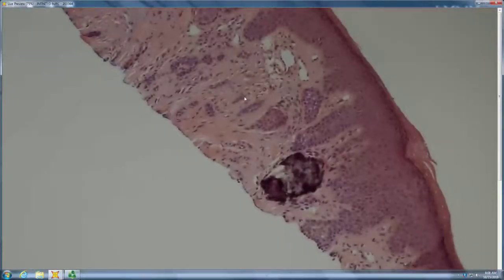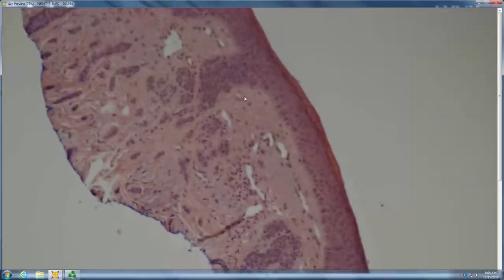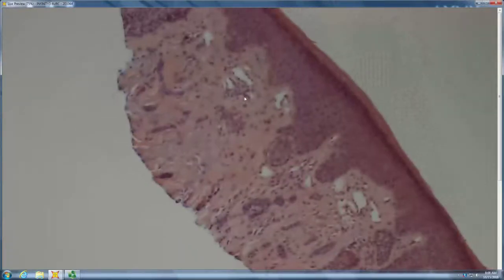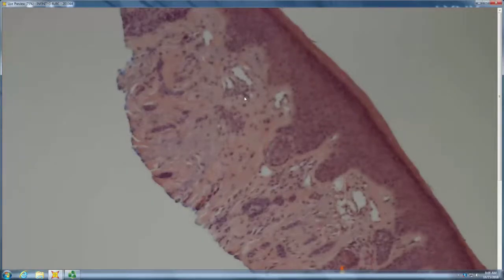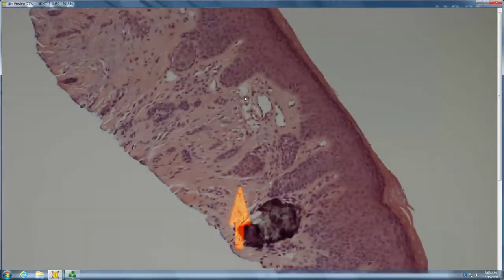Cells look somewhat... Is that like calcium in there? So there is calcification. They kind of look somewhat gray. I would say probably melanocytic. What if they're epithelial and they're forming these little paisley tie or tadpole-like structures? So paisley tie differential. I have calcification. I'm a young woman, and this is a donut-shaped lesion on my cheek.